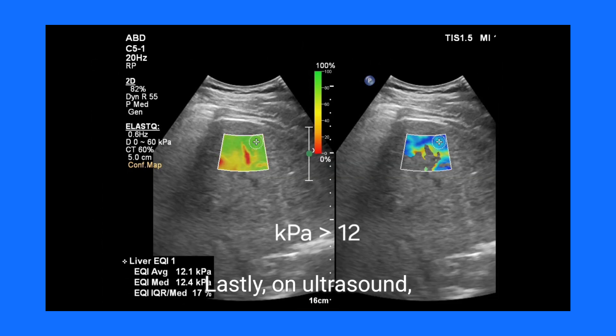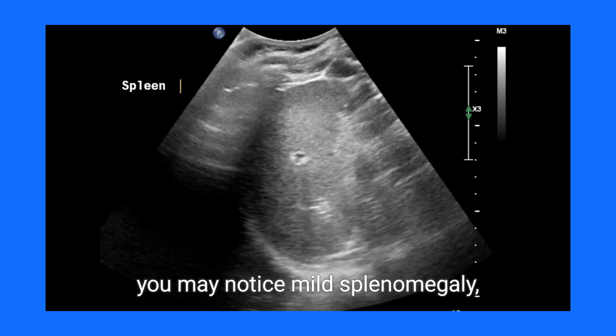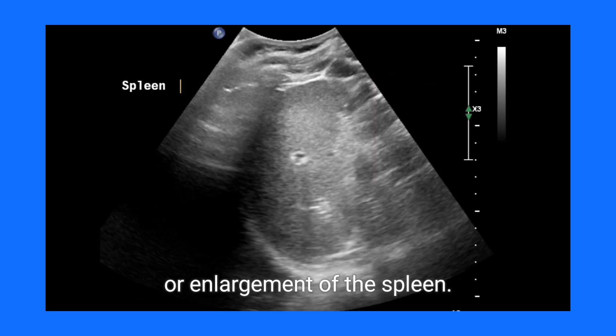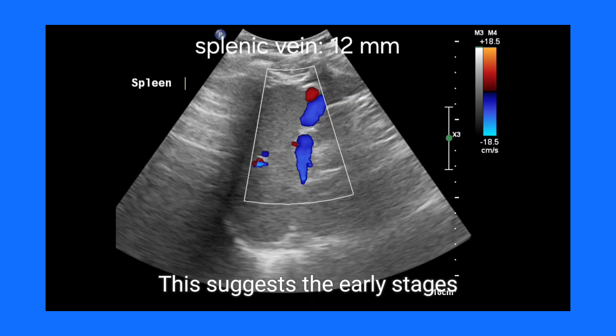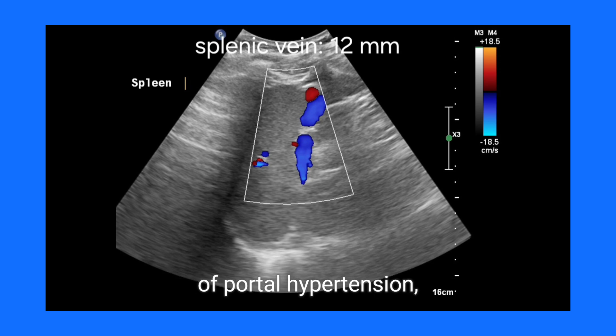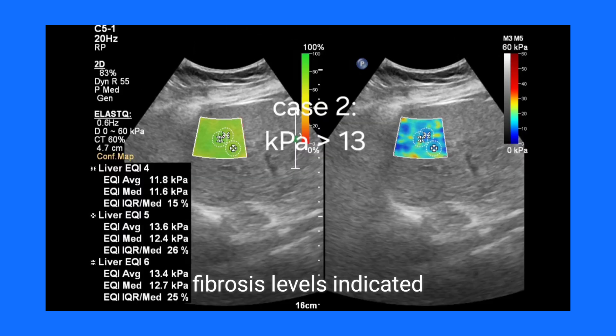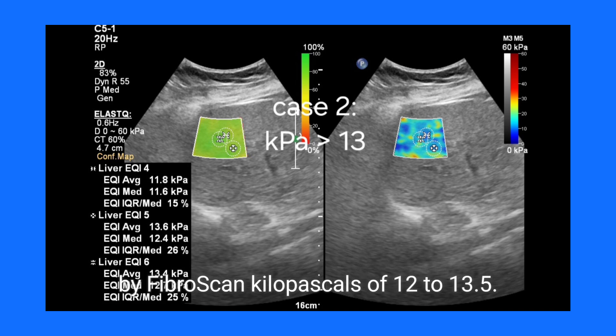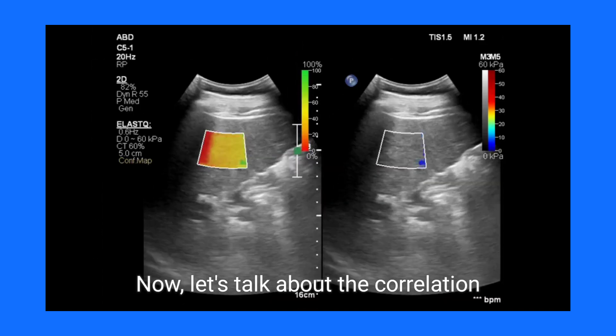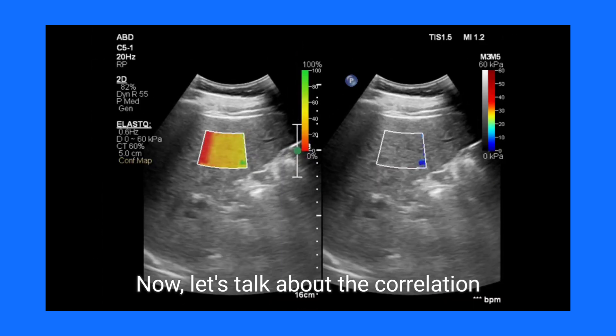Lastly, on ultrasound you may notice mild splenomegaly, or enlargement of the spleen. This suggests the early stages of portal hypertension, which typically coincide with fibrosis levels indicated by FibroScan kilopascal values of 12 to 13.5.